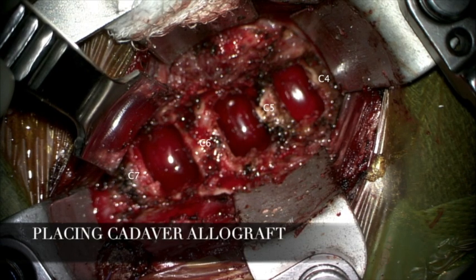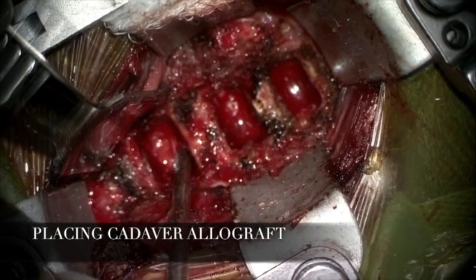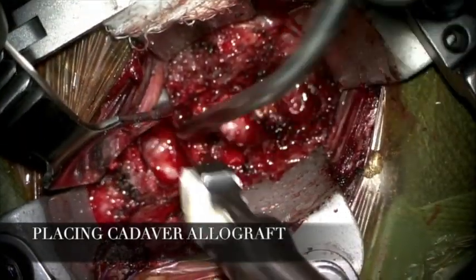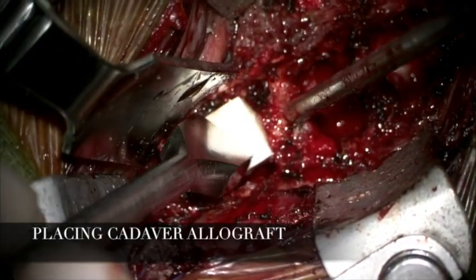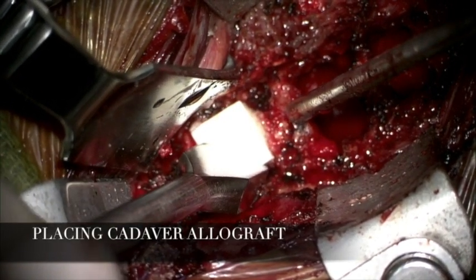This is the final view after microsurgical discectomy at the C4 to C7 levels. We then started using graft-sized trials starting from C6-7. Appropriate size cortical allografts filled with bone putty were placed in position, achieving intervertebral body fusion at C6-7, and they were tapped down just a millimeter below the anterior surface of the anterior cervical spine.